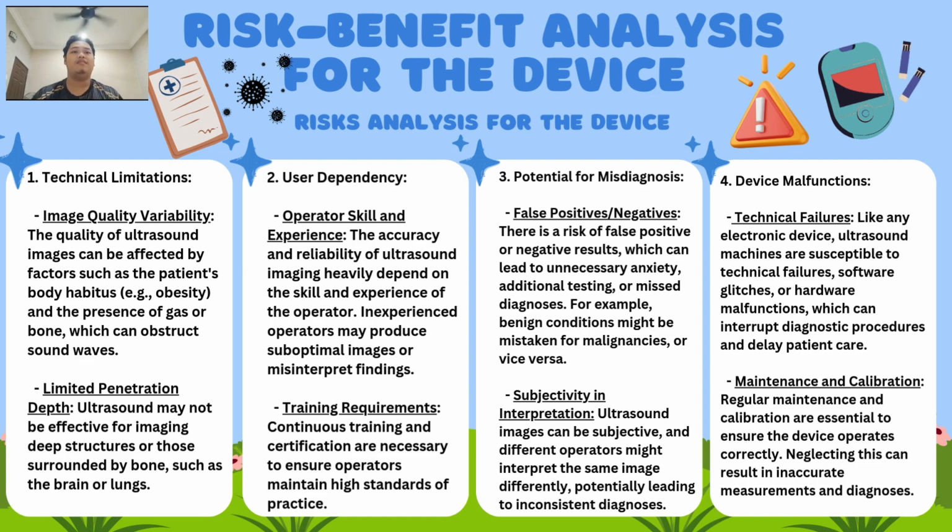malignancy or vice versa. The second one is subjectivity in interpretation. Ultrasound images can be subjective, and different operators might interpret the same image differently, potentially leading to inconsistent diagnosis. The last risk for the device is device malfunction.